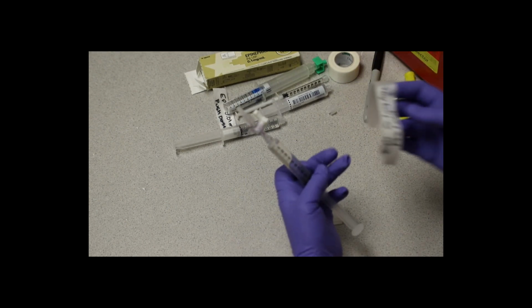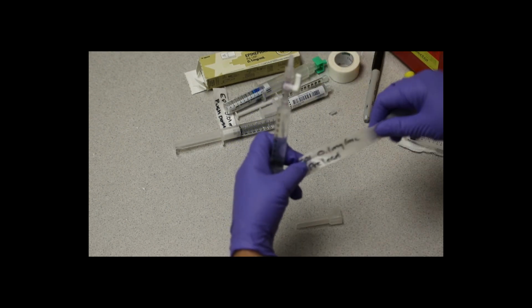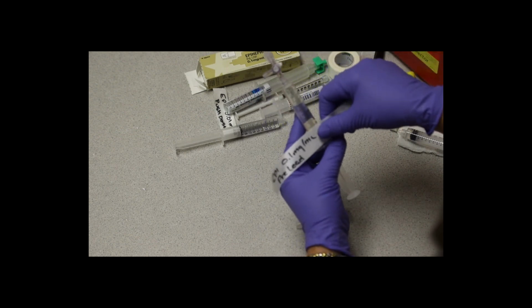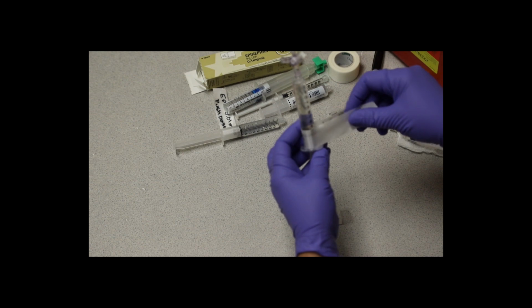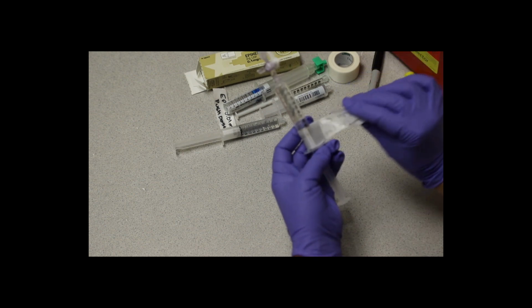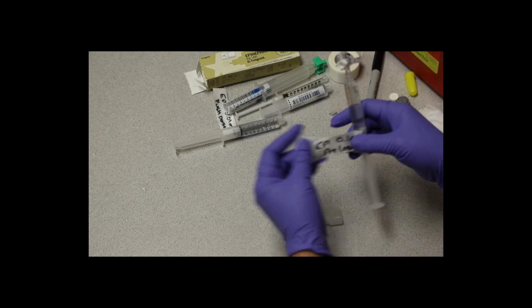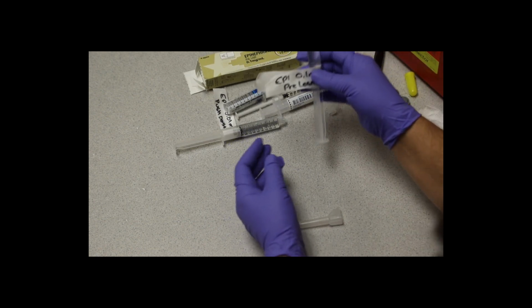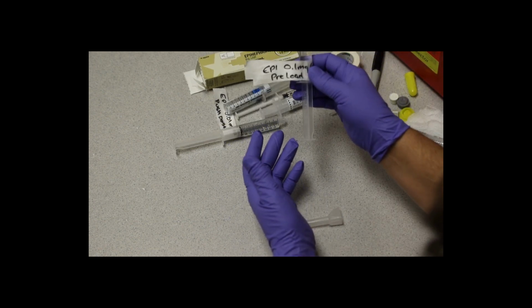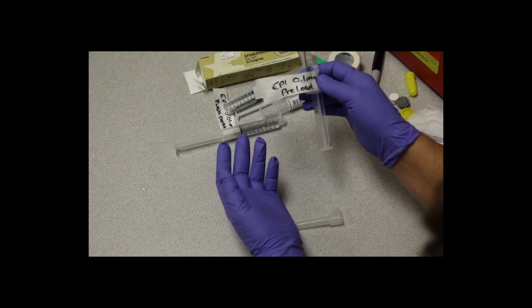We're going to label this as 0.1 milligram per ml epi. You might note it better as your preloaded dose. And you're going to substitute this into the same mixture as you would where the preload was. So now you dilute this 1 ml of this in 9 cc's of normal saline.